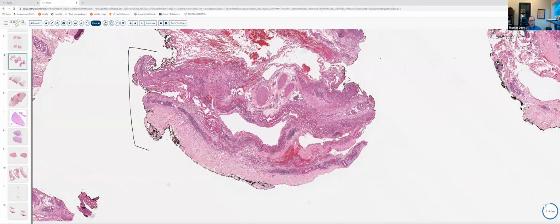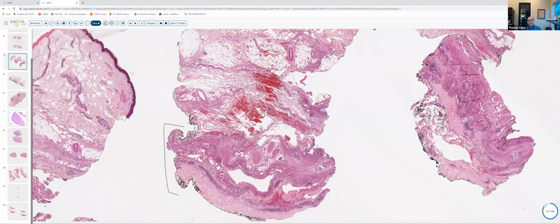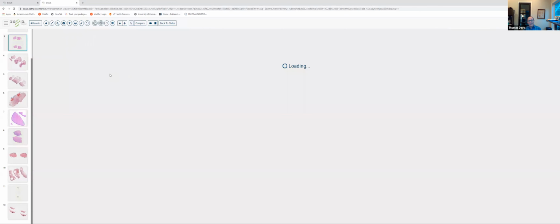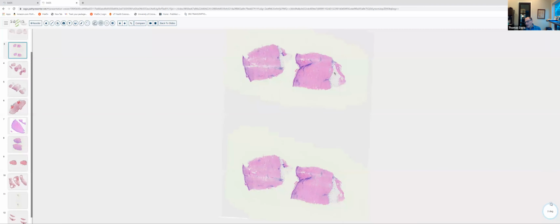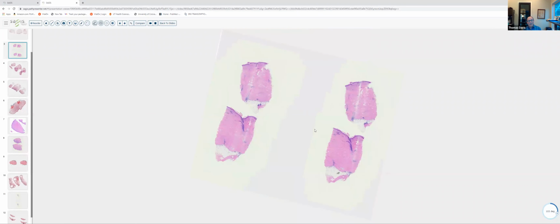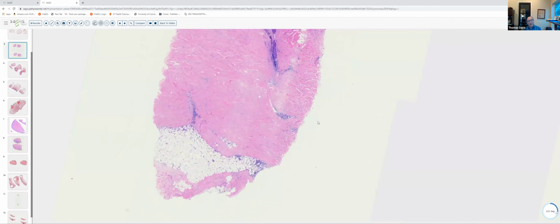So we've kind of started with our sclerosis up top in the papillary dermis, looking at LS and radiation dermatitis, then looked at a condition characterized by sclerosis in the deeper reticular dermis and now in the fascia. Occasionally, just one point to make before leaving, biopsies of morphea, let me go back to that slide here, the sclerosis can occasionally extend from the reticular dermis into the underlying fat.